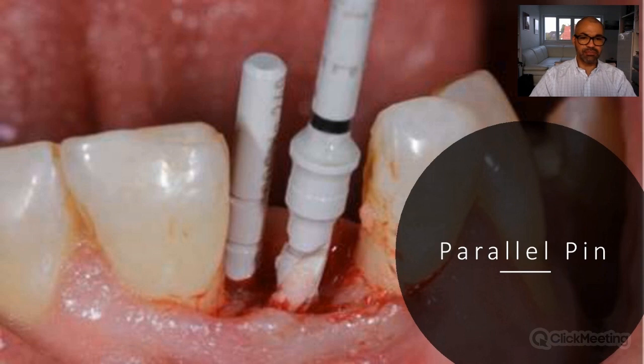I do believe that sometimes the meaning of this canalis is overestimated. So what we can do is we place a parallel pin of your implant system inside the canalis, and this gives your direction for an implant, because especially in areas where you have crooked or tilted tooth angles, it might be a help to identify the right position.